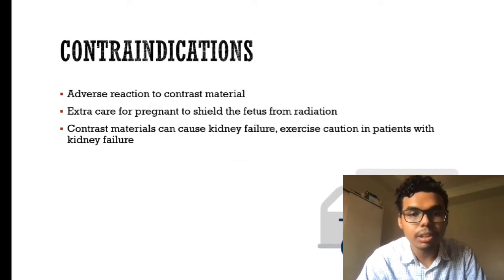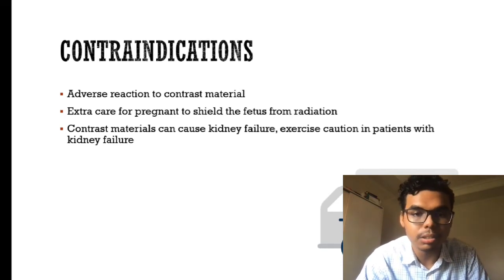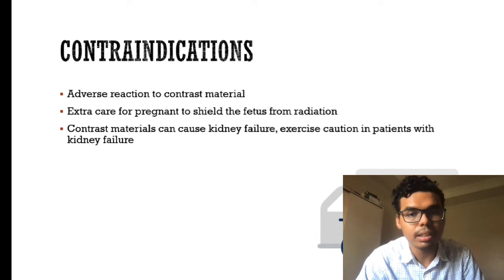Intravenous pyelograms should not be considered in patients with adverse reaction to the contrast material, as it can cause unwanted anaphylactic shock. In pregnant patients, extra care should be used to shield the fetus from unintended radiation. Intravenous pyelogram should also be used with caution in patients with kidney failure, as the use of contrast materials can cause kidney failure. That's all from me. The presentation will be continued by my friend. Thank you.